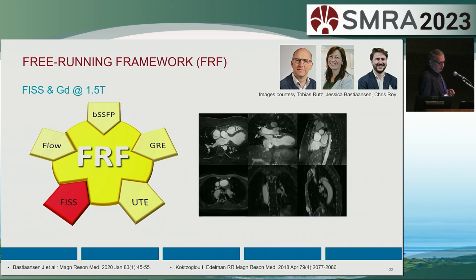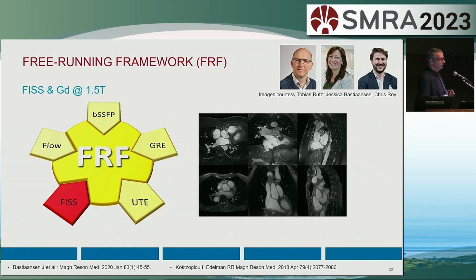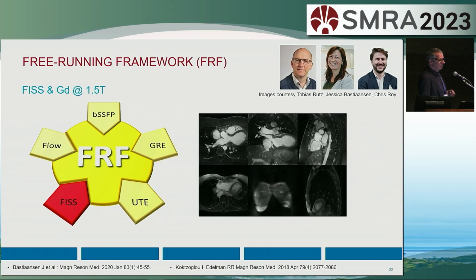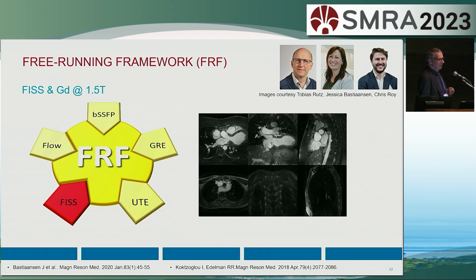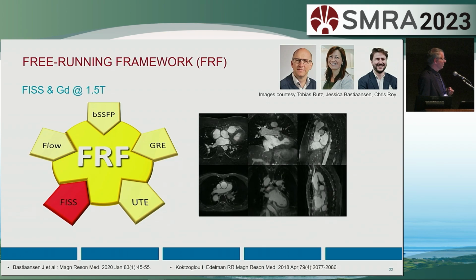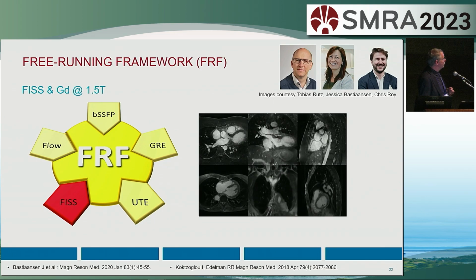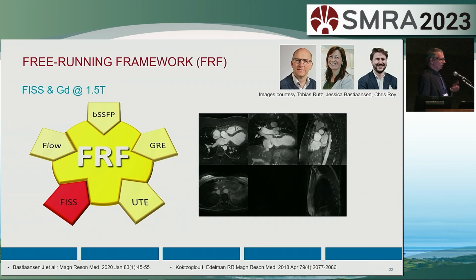Increasingly at our institution, this cardiologist here, Tobias Rutz, is now using a FIS technique, which was originally developed by 2 people here in the room, by Bob Edelman on the one hand and our esteemed chair, John Kokzoglu on the other hand. And we were fortunate enough to enter a collaboration with them and to combine their FIS idea with our free-running framework.